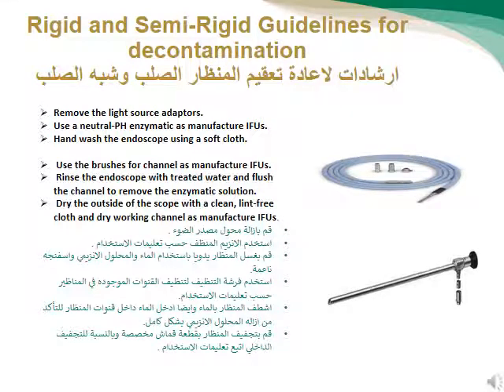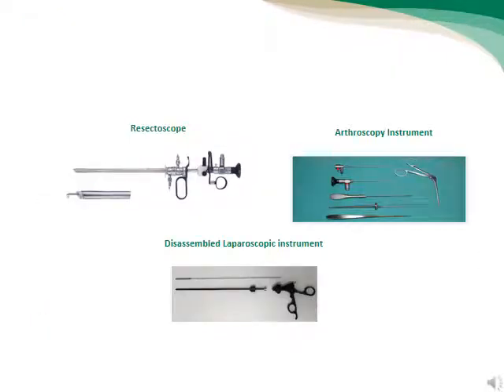Rigid and semi-rigid guidelines for decontamination: Remove the light source and secure the adapters. Use a neutral pH enzymatic solution as per manufacturer IFUs. Hand wash using a soft cloth, and use a brush for channels. Rinse the endoscope with treated water and flush the channels. Dry the outside of the scope with a clean lint-free cloth.